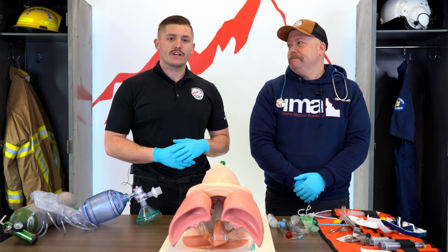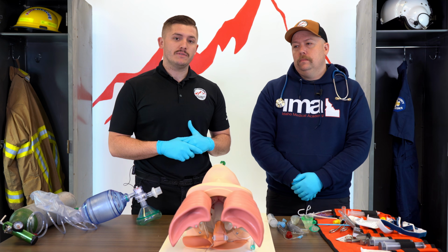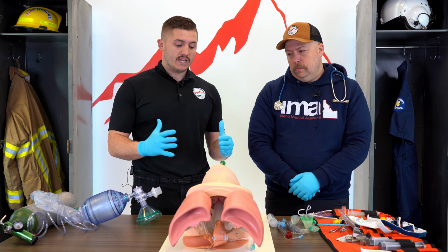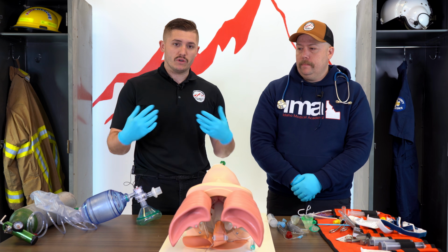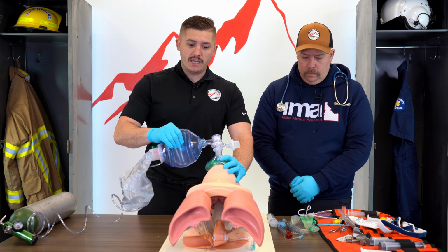Okay guys, now we're going to go over some ILS airway interventions and some ALS airway interventions and how you as an EMT basic could assist your partner. Typically, we get on scene, the medic is going to be doing an IV and medications while you as an EMT basic might be at the airway. You've placed your NPA, you've placed your OPA, and you're bagging your patient, okay?